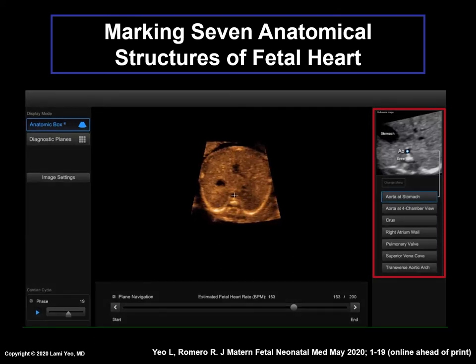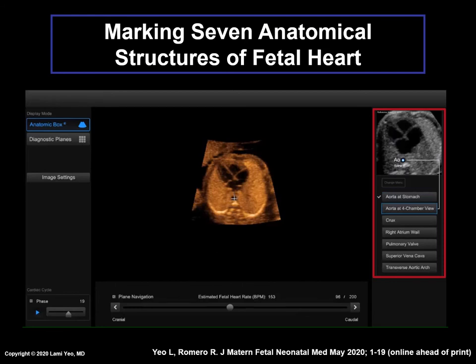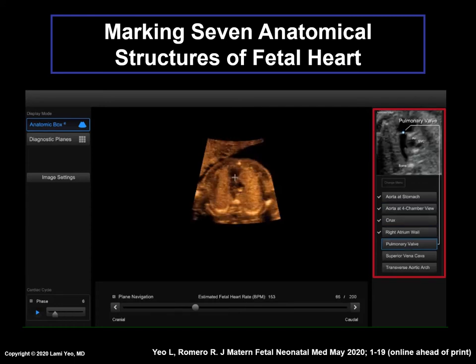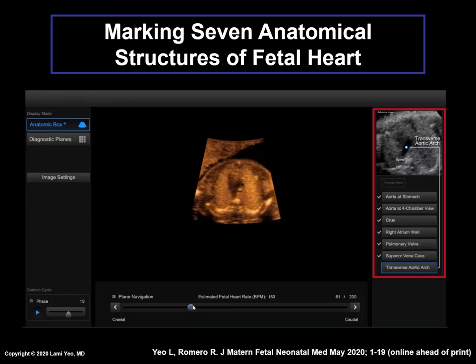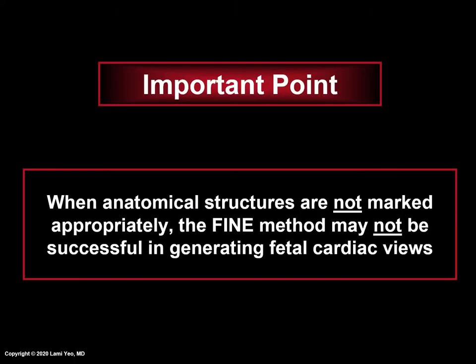First, the aorta at the level of the stomach is marked. Next, the aorta at the four-chamber view, the crux, right atrial wall, pulmonary valve, superior vena cava, and the transverse aortic arch. An important point is that when anatomical structures are not marked appropriately, the FINE method may not be successful in generating fetal cardiac views.